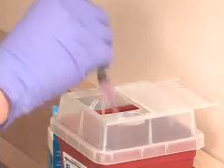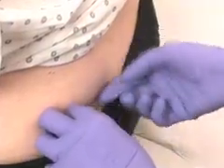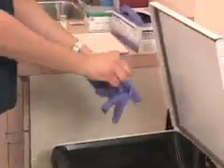Discard the syringe into the sharps container. Apply a bandage strip to protect the patient's clothing. Do not massage the injection site. Remove your gloves and wash your hands.